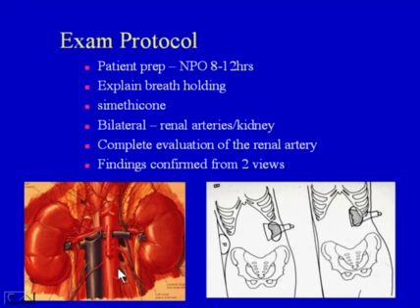However, the problem with the anterior approach, as you can see, is that the renal arteries will frequently show up at 90 degrees off of the aorta in your image, and that does not leave good Doppler angles. So in order to assess the patient with the best Doppler angles, the lateral decubitus position is the better position. It's also helpful to place a pillow under the patient's side that they're lying on, because with the pillow, you can now put the arm above the head and open up and try and move the rib cage away from the kidney.